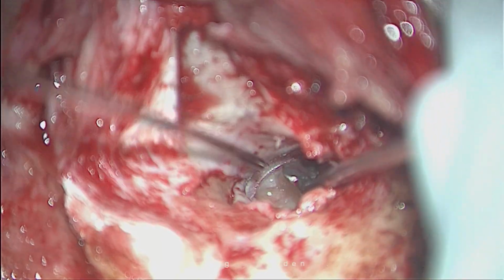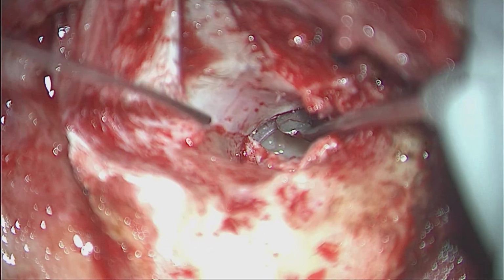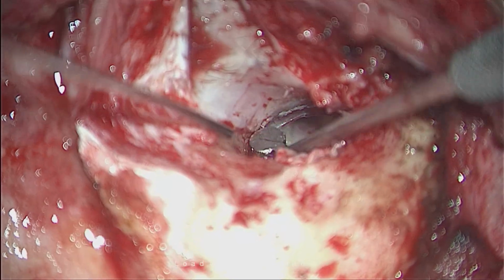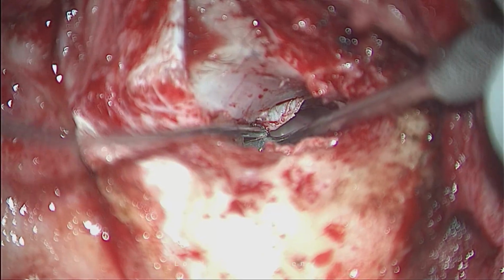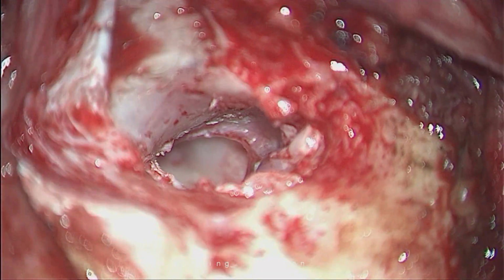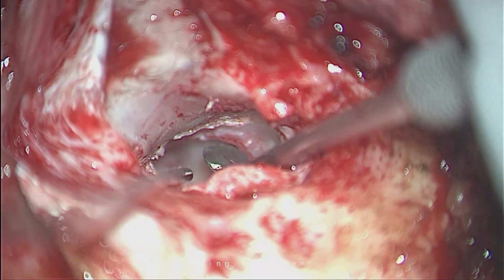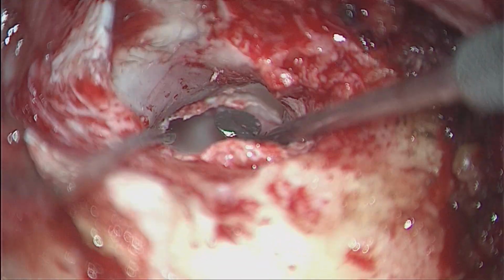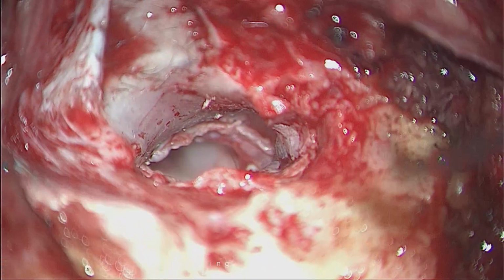Sometimes if you have a big hump, you can elevate and drill the hump. So simply I am extending this and slowly elevating at all levels together to avoid tears in the flap. And anteriorly I can go again beyond the margin. This is your anterior superior margin and I am going beyond that. I hope it is very clear to everybody.